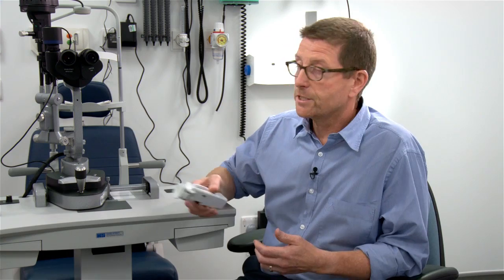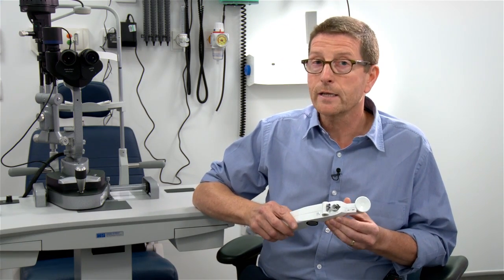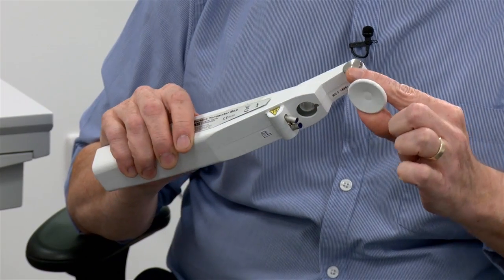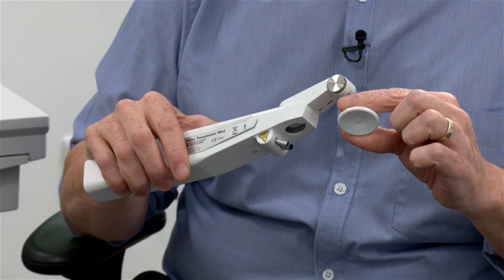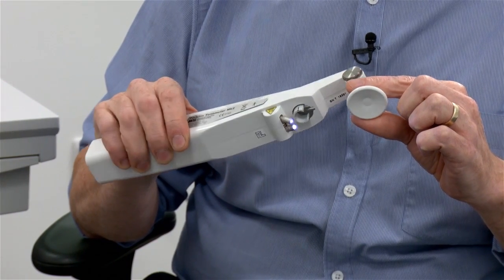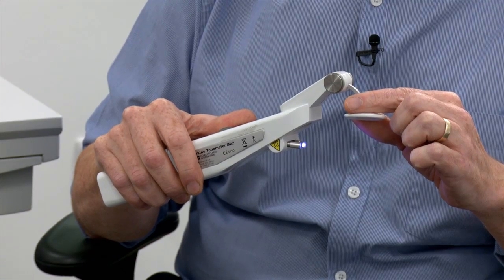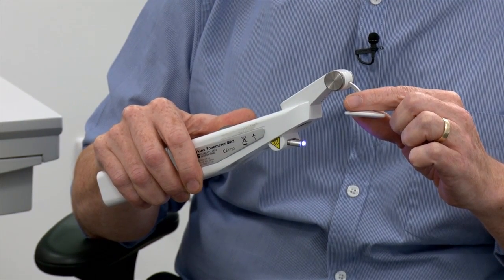You want a technique of similar status and standing and equally easy for the patient, so in those cases I reach for my Perkins. It's the same principle, the same technique, but rather than using it on a slit lamp you use a handheld one — sometimes with the headrest, sometimes without — the same basic technique, just as valid, just as accurate, and using the one-touch, much less likely to cause any damage to the eye surface.